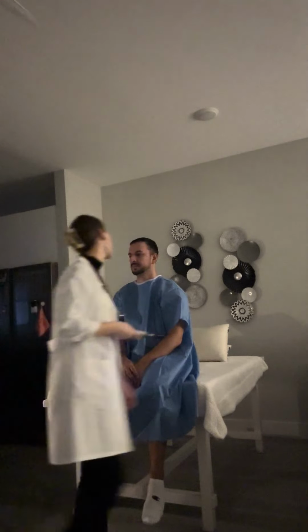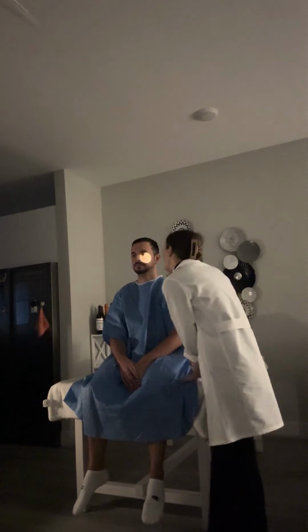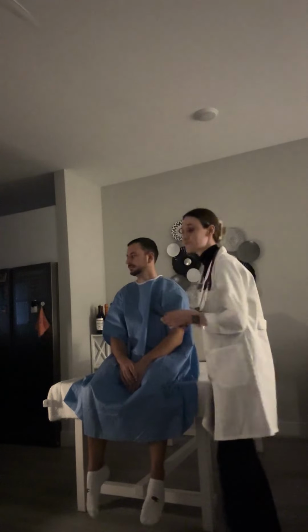Now we're going to look at your left eye with my left eye. I'm going to move in medially here. There's a positive red light reflex, no AV nicking, no opacity. The optic disc is visualized and the macula is present. Okay, very good. So now we're going to move on to your nose.